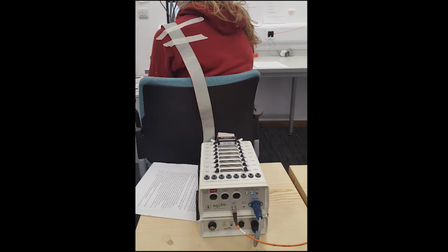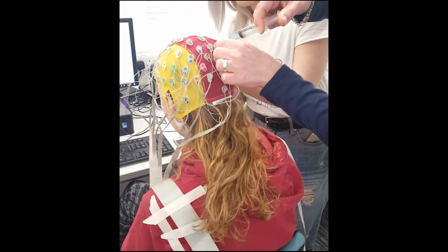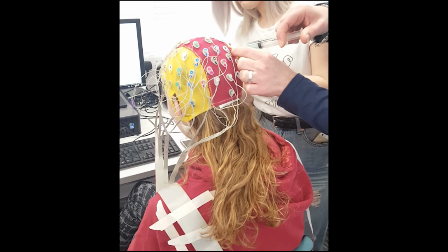Electrodes are separated into two cables, which are attached to A and B ports on an amplifier, which is connected to the recording computer and stimulus computer. The amplifier is then turned on. Electrodes are then placed on the cap along with gel, which helps the current flow.